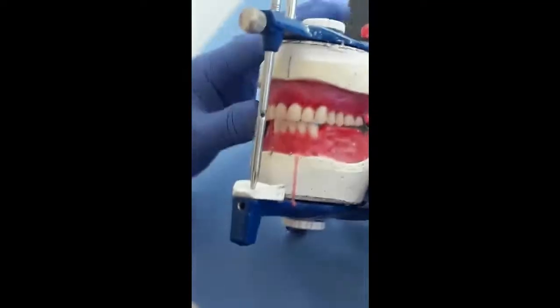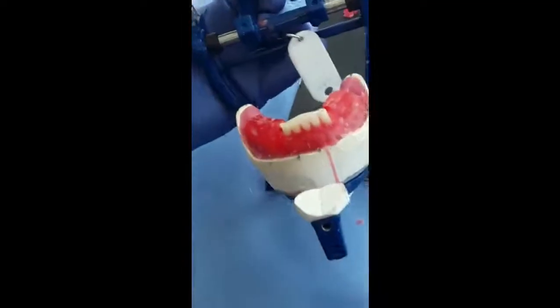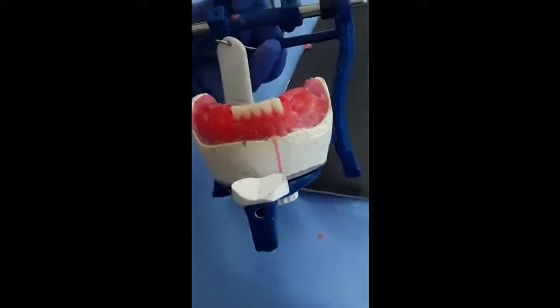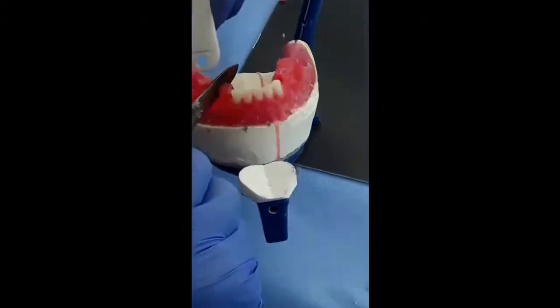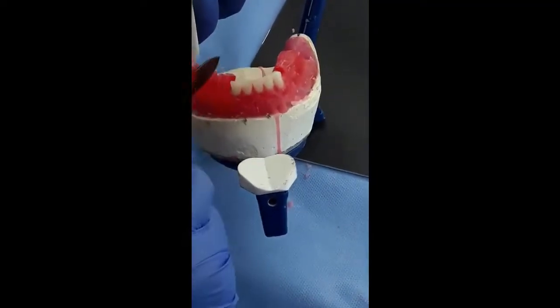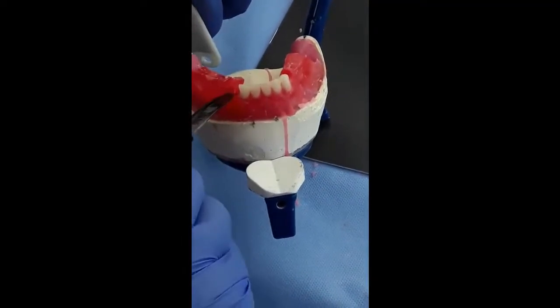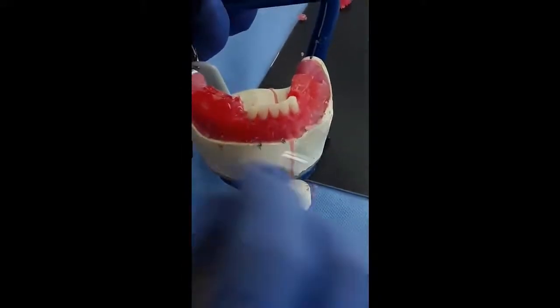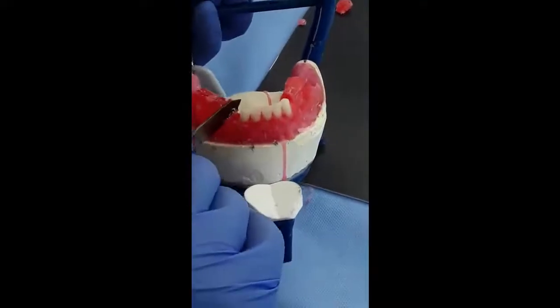Now I'll proceed to put the lower right canine in the same way. And you can see it is an easy procedure once we understand what we are doing and what we are looking for.